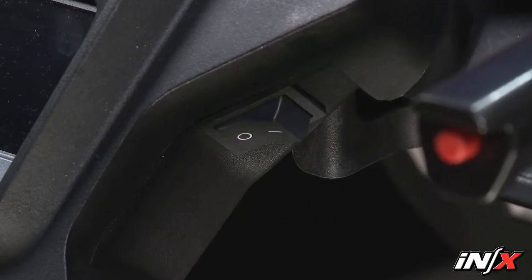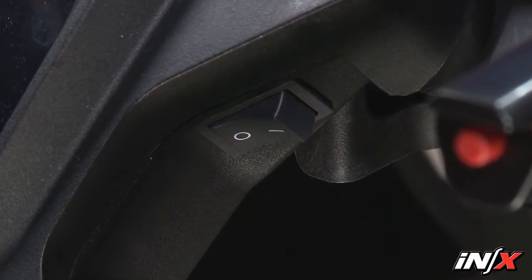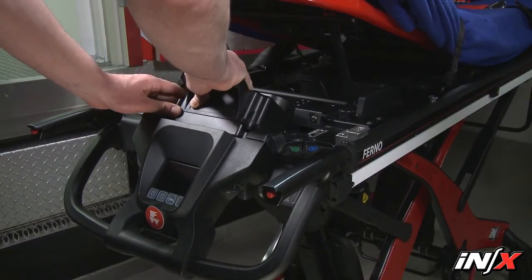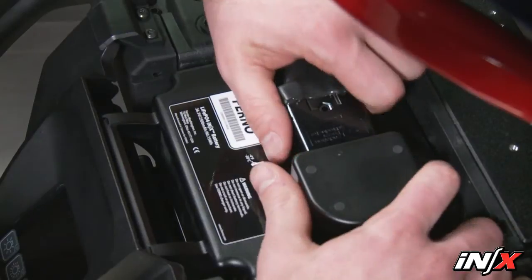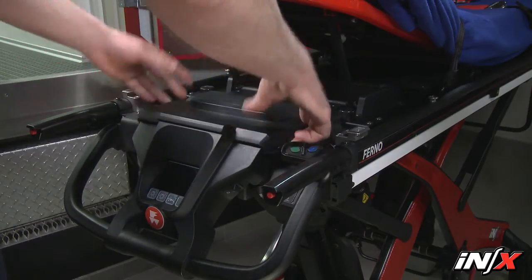To connect the battery to the NX, verify the power switch is in the off position and raise the shock frame. Angle and slide the battery into the cradle. Press down to secure the battery in place in the cradle. Connect the battery cable plug to the battery port. Replace the battery cover and lower the shock frame.